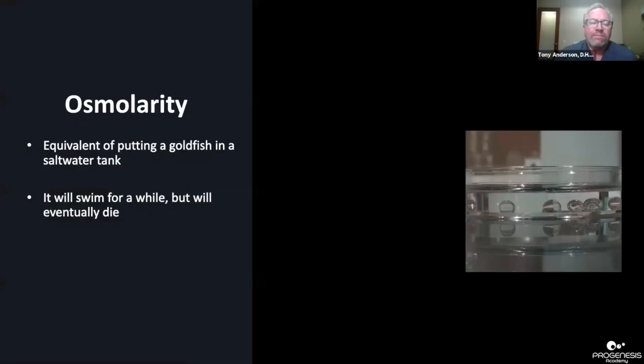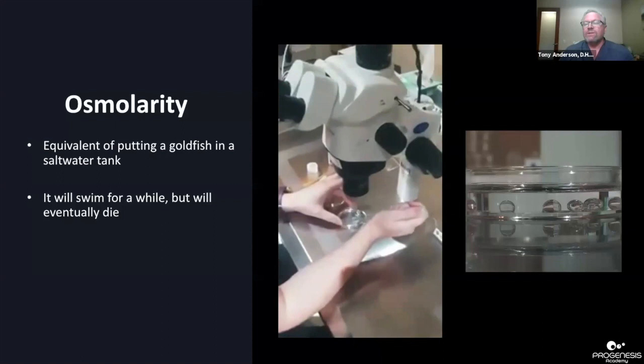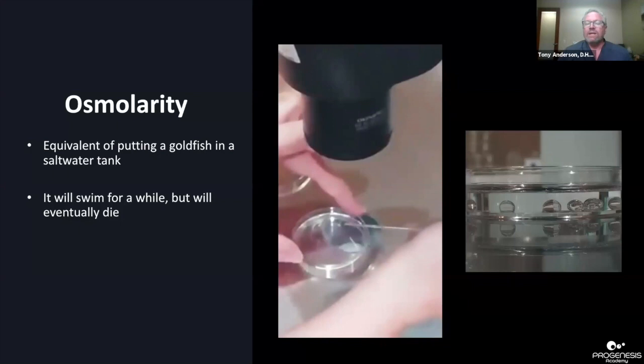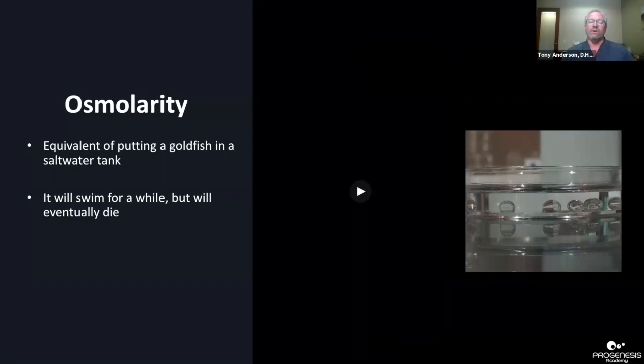And the osmolarity, there's going to be a video here kind of playing as we go. I've been making dishes the same way since working with Klaus. I remember when we started doing oil cultures, thinking about how much work that was, to have to add oil to our culture system, but we actually fire polish a Pasteur pipette and underlay that media into the dish. I just use the regular Nunc dishes. I don't use any of the fancier dishes, the GPS dishes or the Corral dishes. So I don't know if you could underlay in those.